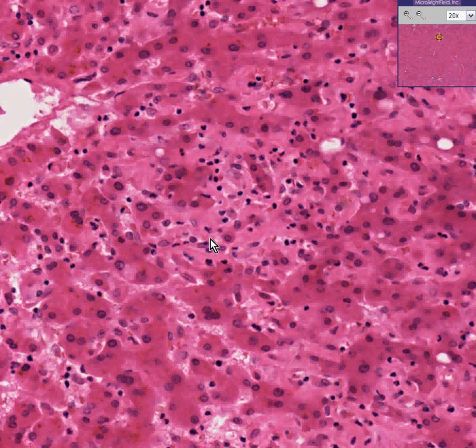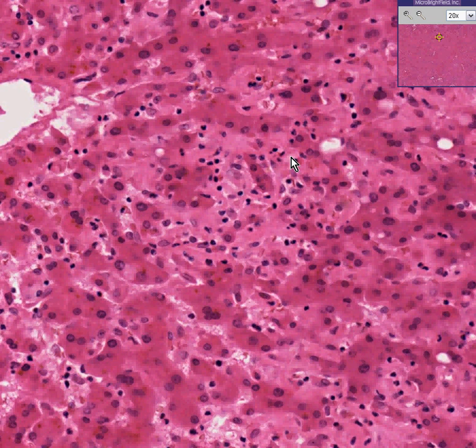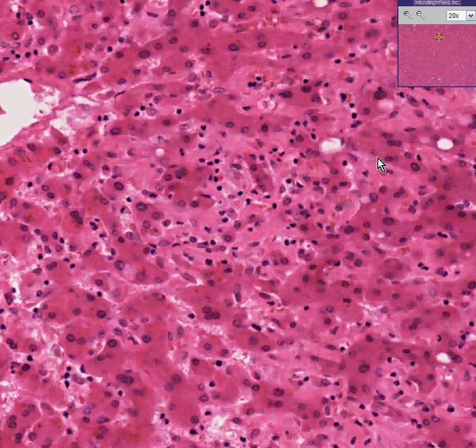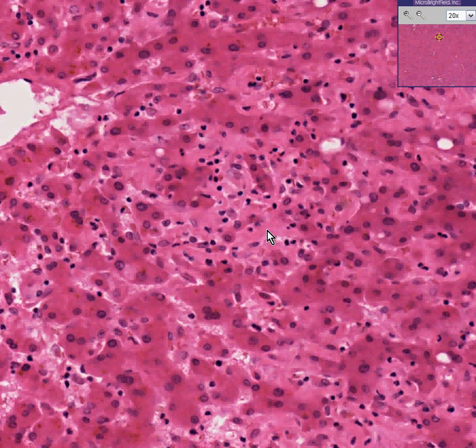So let's say that we decided to take this area and stain it for amyloid with the Congo red stain. Now remember, these red areas are cords of hepatocytes. It's this amorphous pink material that we want to stain. So let's do the Congo red stain on it.